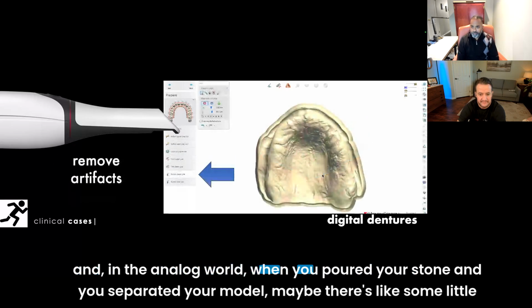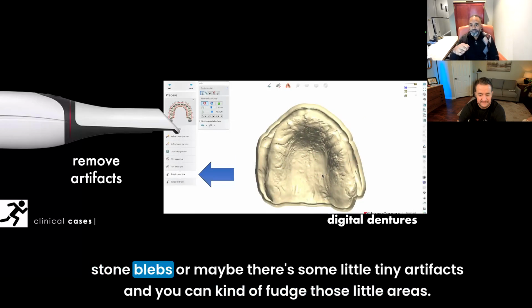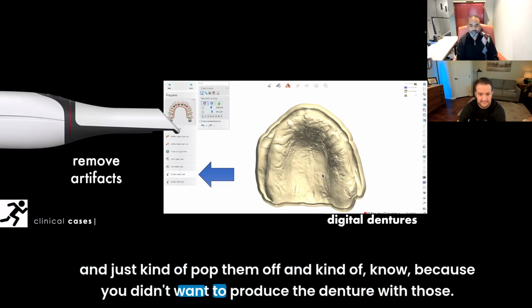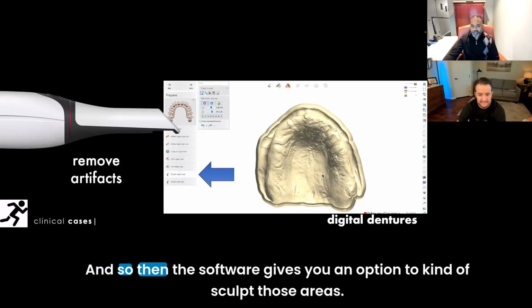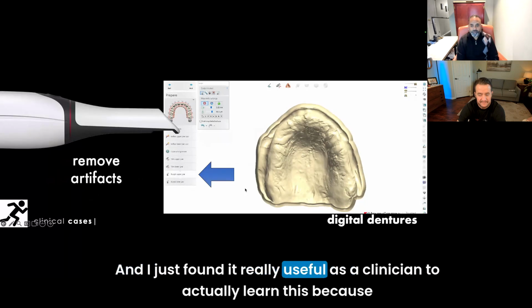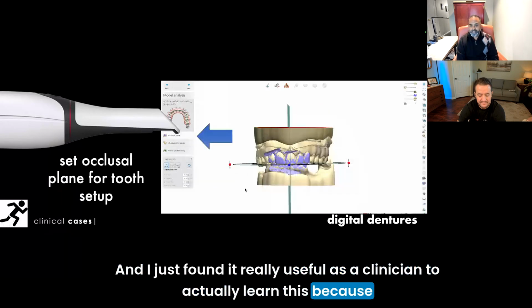In the analog world, when you poured your stone and you separated your model, maybe there were some little stone blebs, or some tiny artifacts, and you could kind of fudge those little areas. I'm not saying fudge in a bad way, but if there were little artifacts, we used to take a Bard-Parker blade and pop them off, because you didn't want to produce the denture with those. The software gives you an option to sculpt those areas. If this was an immediate denture, this would be where I would digitally remove the teeth, instead of having a burr.